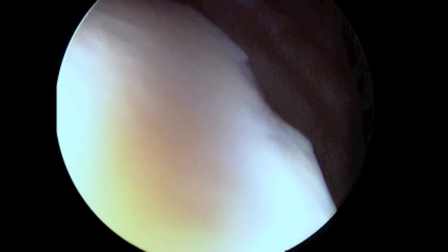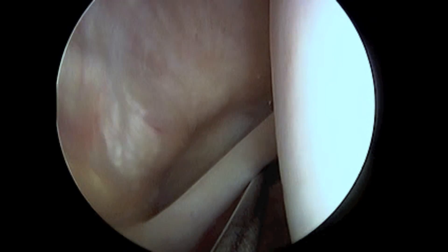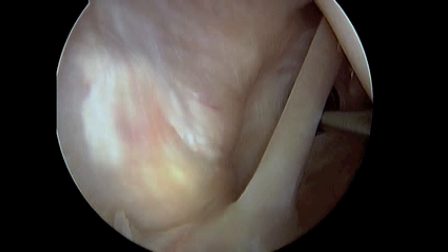Next, we drive the arthroscope posteriorly and superiorly around the normal bare area of the humeral head and return to our original vantage point where we first visualized the long head of the biceps tendon.